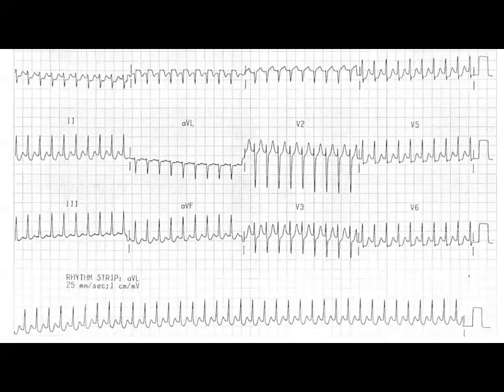If anyone would be able to tell me basically on first glance the difference between this and AVNRT, you should skip residency and go right to an electrophysiology fellowship. The reason that people say, well, it's SVT, is that it's really hard to know whether this is AVRT or AVNRT. Truly, most general cardiology fellows will have a really hard time telling the difference. You might need an EP study. You might need, honestly, an expert opinion to try to weigh in on the differences.